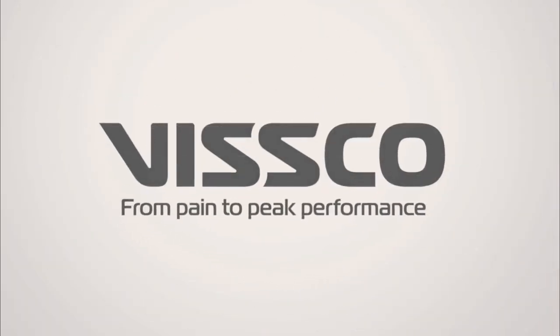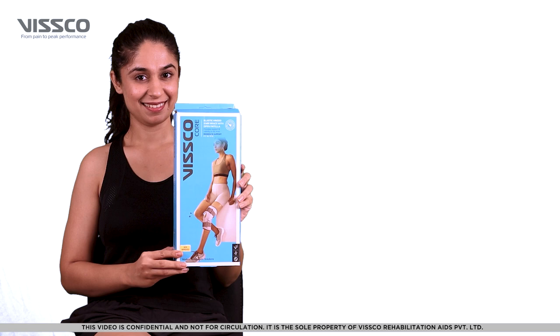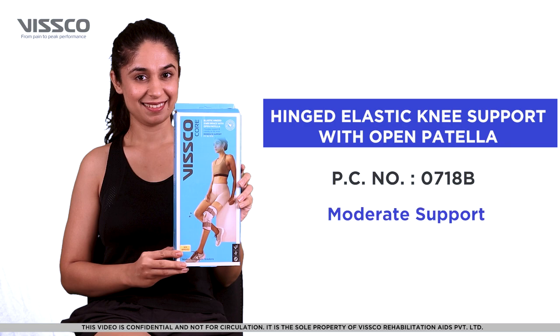Hi there, greetings from VSCO. Let us now see how to wear the VSCO hinge elastic knee brace, product code 0718B.